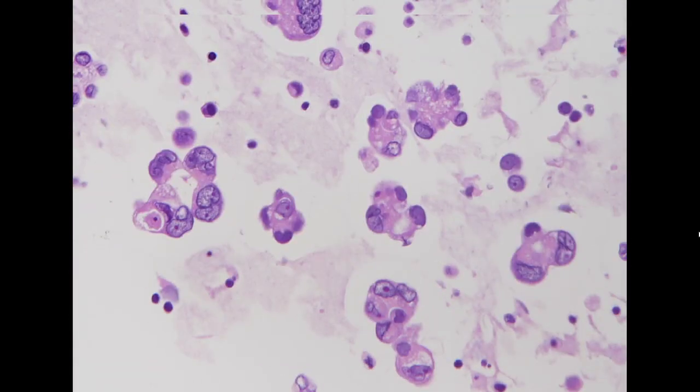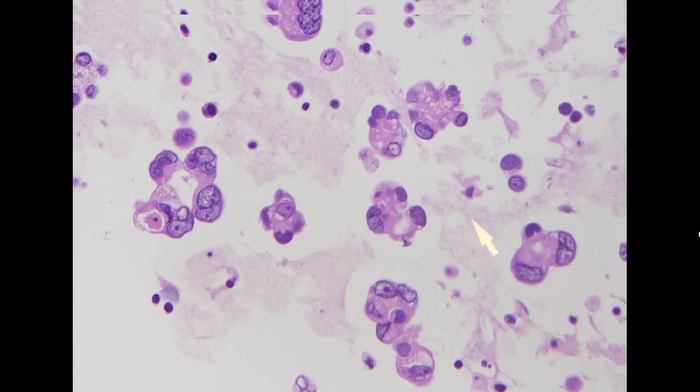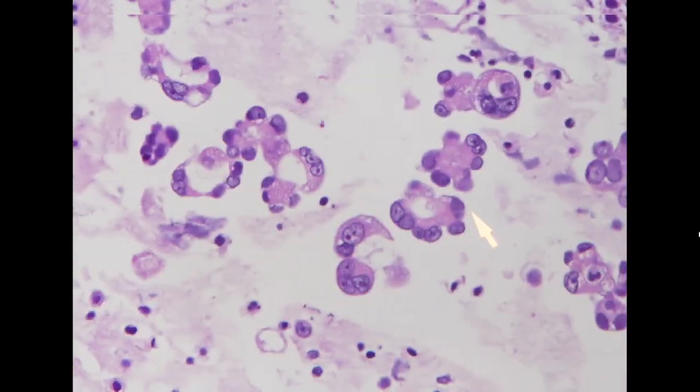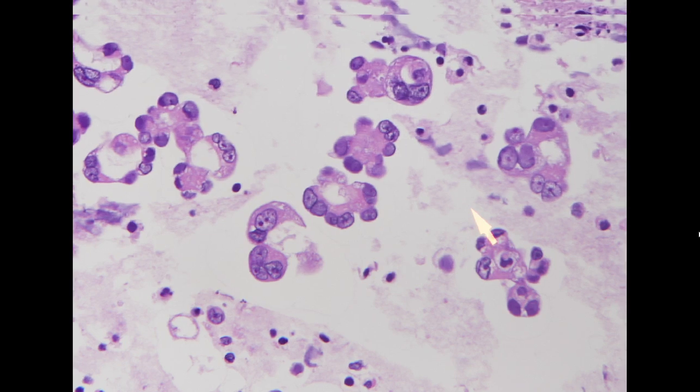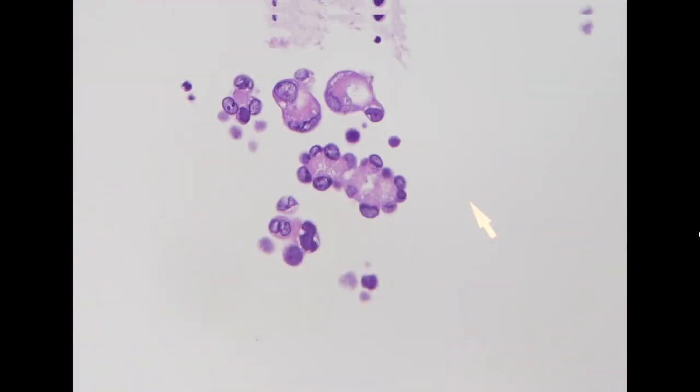Here we have enlarged nuclei, vesicular chromatin, cherry red prominent nucleoli arranged in a tight glandular structure. So we will do a TTF1 stain to confirm that the tumor is coming from the lung, and then we would do EGFR testing for this patient to see if he is eligible for the EGFR TKI.